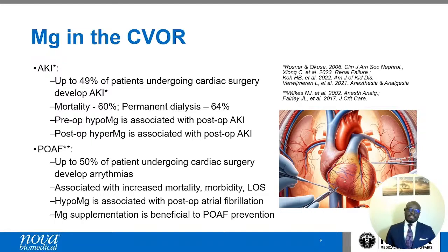What this means is that if magnesium is given indiscriminately, or given without particularly measuring, then you expose some of these patients to post-operative AKI. So some centers have attempted to titrate the magnesium supplementation by serially measuring total magnesium, or magnesium that's available intraoperatively, but this is a logistically cumbersome process because, as you know, to measure total magnesium, you need to collect the blood, send it to the lab, spin the blood, collect the serum, and run the sample before getting the results back in about 20 to 30 minutes. And this is not ideal in a peri-op period to measure and react to these magnesium levels.